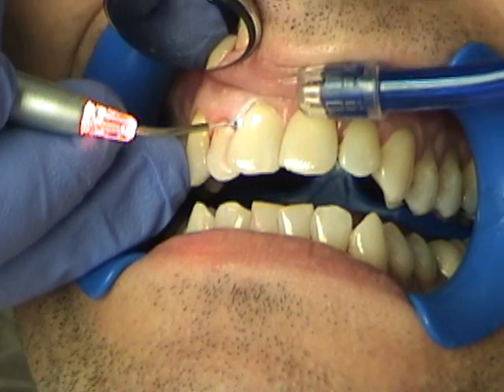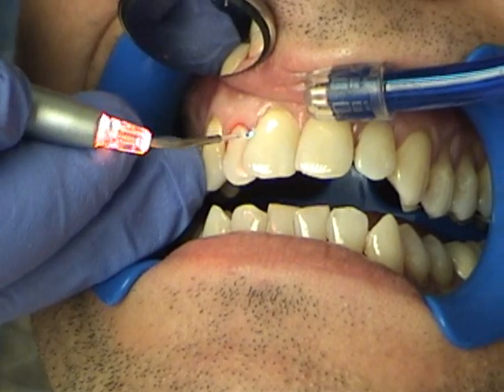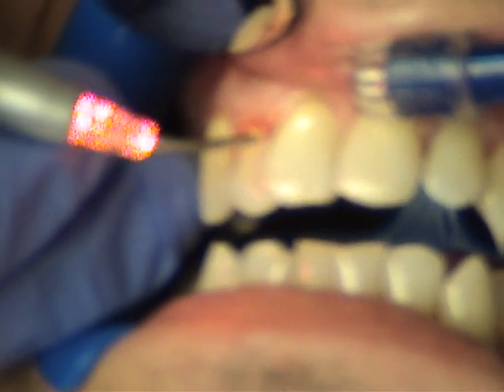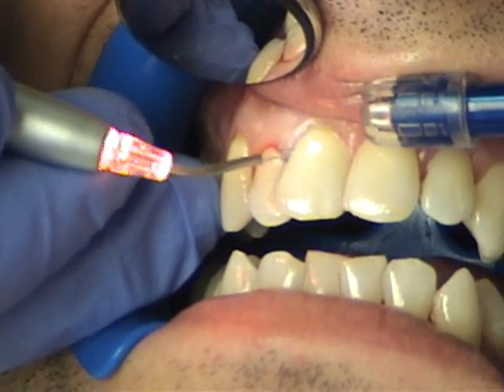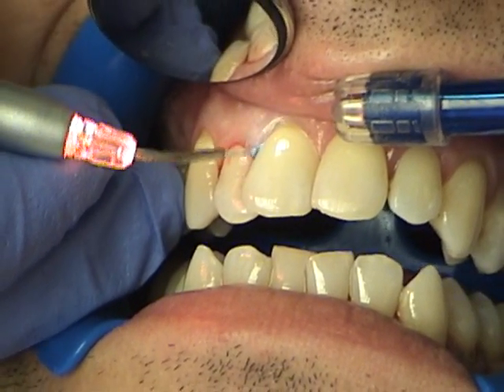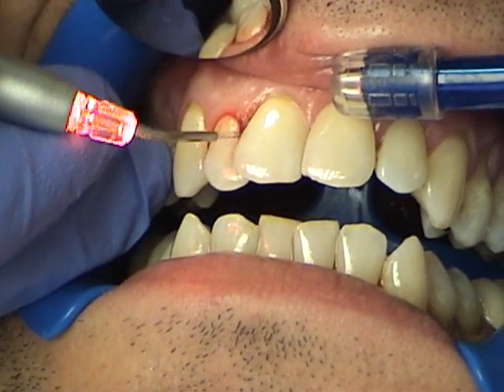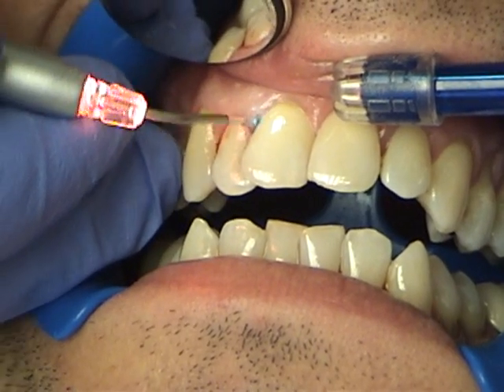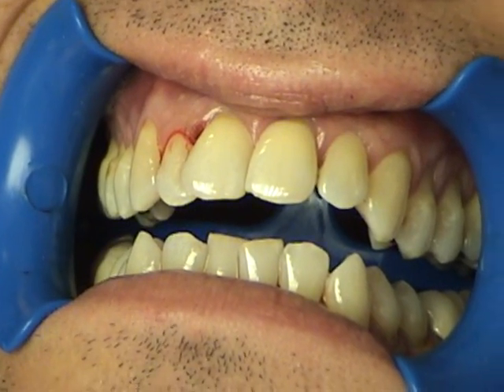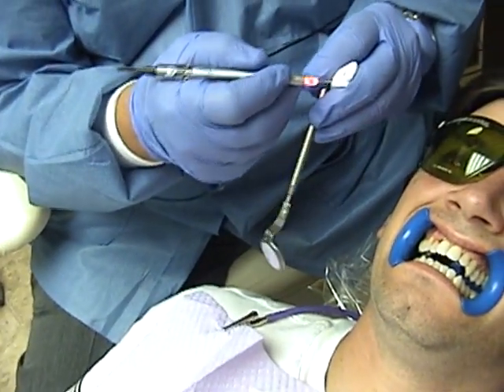The object is to start off at the lowest power. We're getting a little ablation now. What I'm going to do is put it to the depth of the pocket and withdraw a millimeter. We're going to work it around inside the pocket to remove the epithelial lining — a little hemostasis — and work our way out of the pocket back and forth. I prefer this technique over the sewing machine method, as it removes the epithelium more completely. Then we clean our tip by running the laser tip through the gauze.